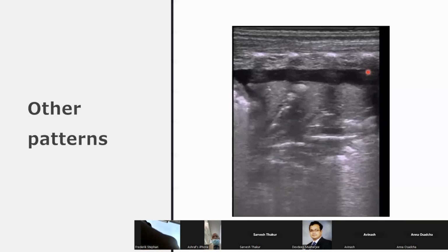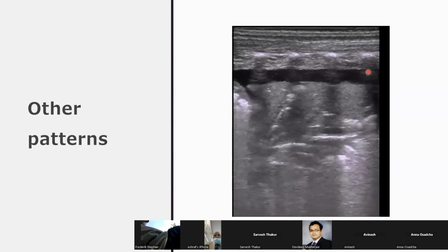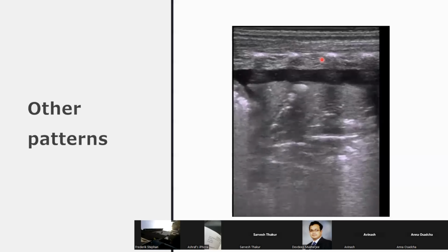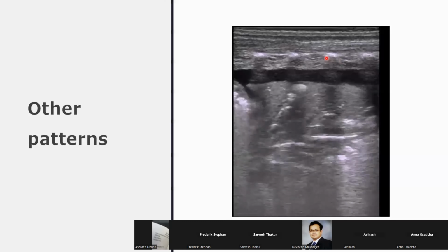Okay, let's stick to the protocol. Sure. This is where you're going wrong, both of you. And that's why it's so important you stick to the protocol. So what does the protocol for lung ultrasound interpretation say? Bat wing sign. Okay, visible? Oh, I can see the.